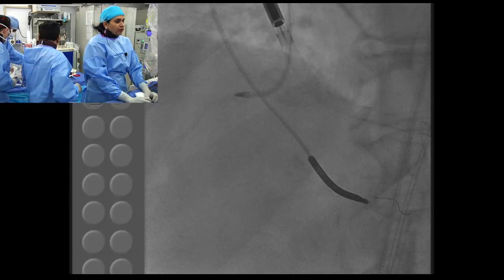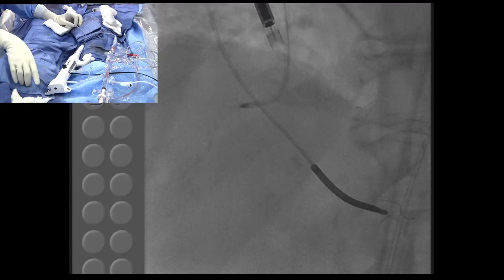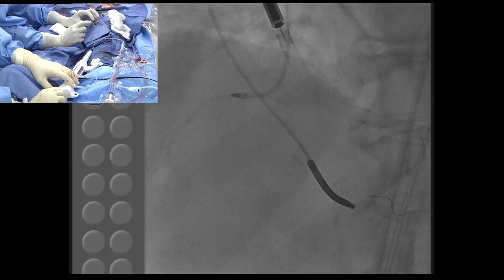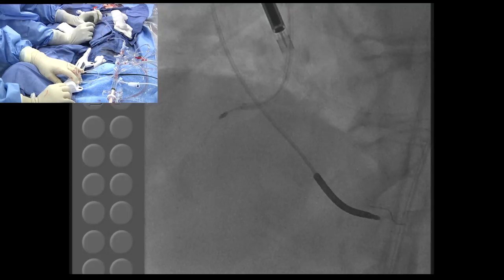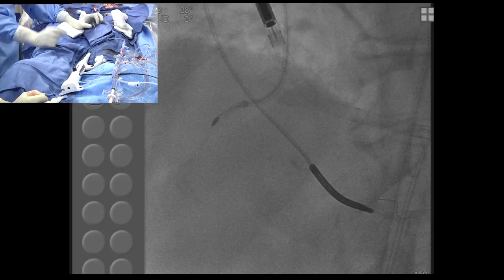So the goal in this kind of situation is don't get too aggressive. What you do is go on dyna, and your assistant will help you push the button, and I'm going to just go forward with dyna. And how do you do this movement in the proximal part? It has to go in a little bit. Okay. So I'm just going forward. Good. So now the burr is in the proximal part of the RCA. We haven't caused any trauma. We knew that there was no lesion at that level.